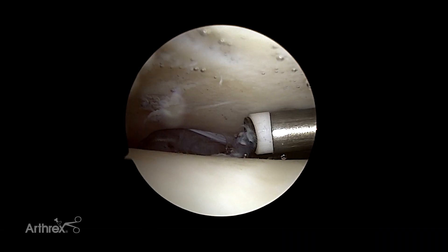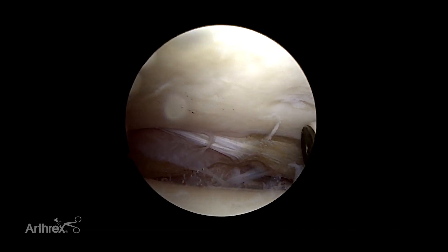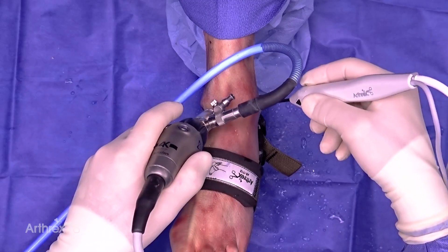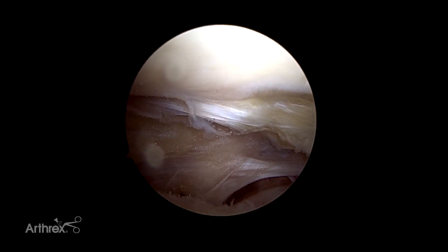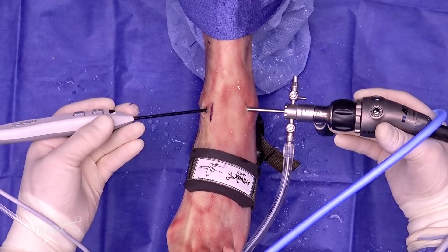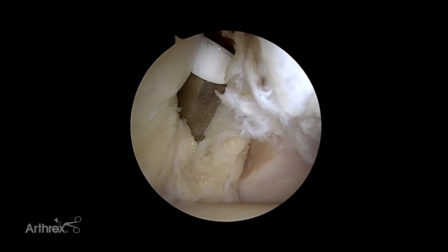In arthritis, a lot of times we see this shag carpet appearance and you want to get rid of it. You can literally take this probe, put it on coag, and just come in and clean those areas up — just nicely get rid of that shag carpeting by kind of mowing along it. But if you look down at the cartilage, you'll notice that I really haven't damaged the cartilage in any way.